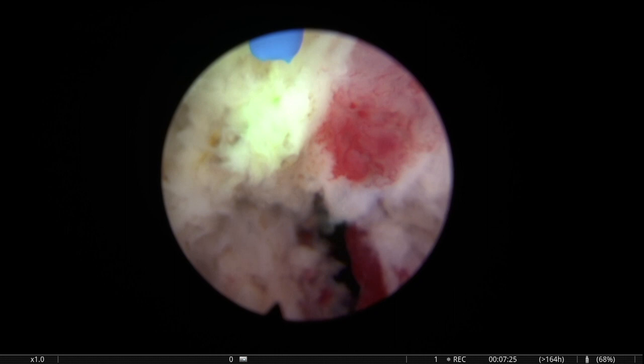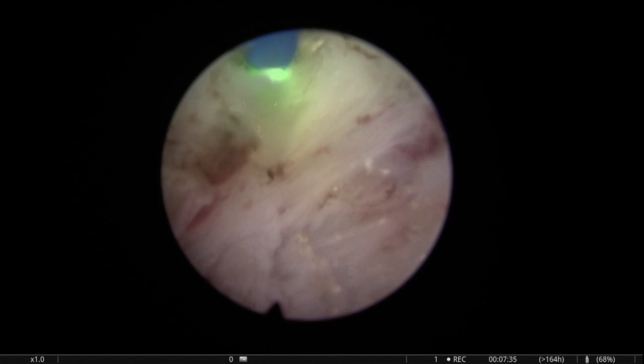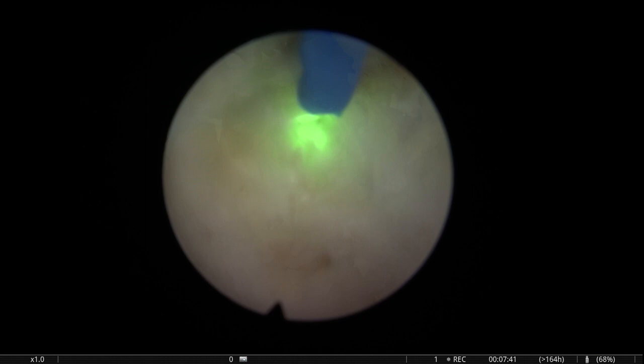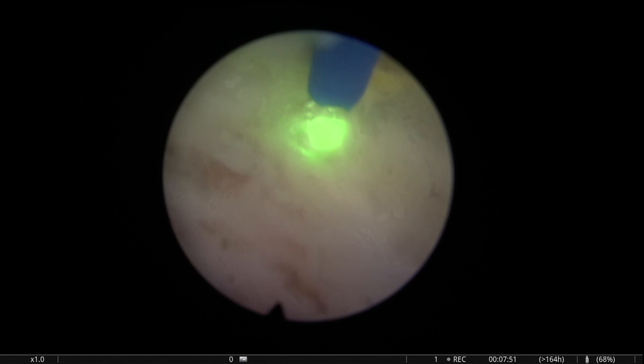You see, this is the mucosa of the sphincter. These are the 12 o'clock fibers. Initially, they are parallel to the fiber, but as I said, when you start descending the nose of the adenoma, they verticalize, so you can cut them. And initially, I tried to cut them also to make an initial liberation of the sphincter.